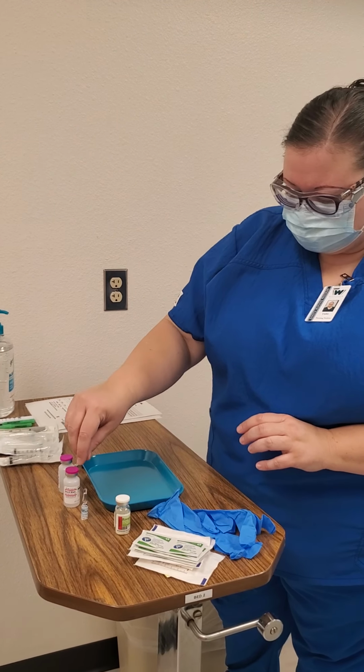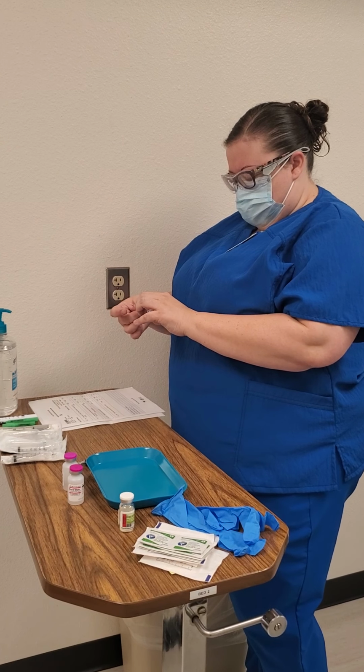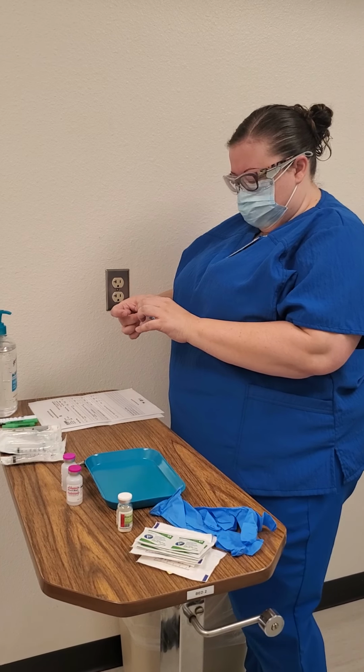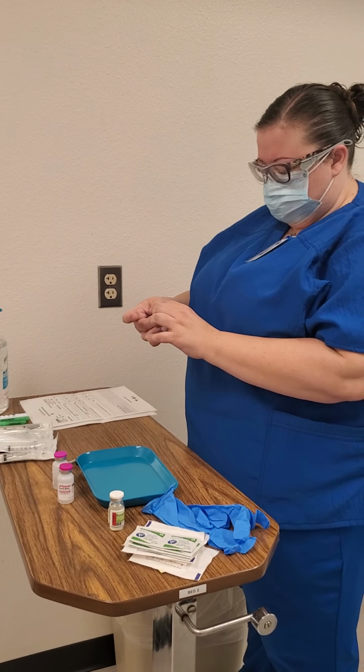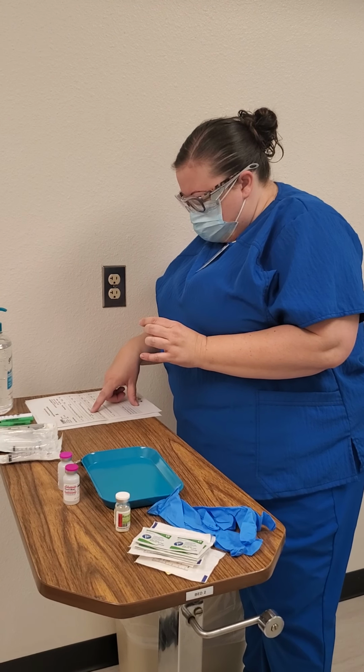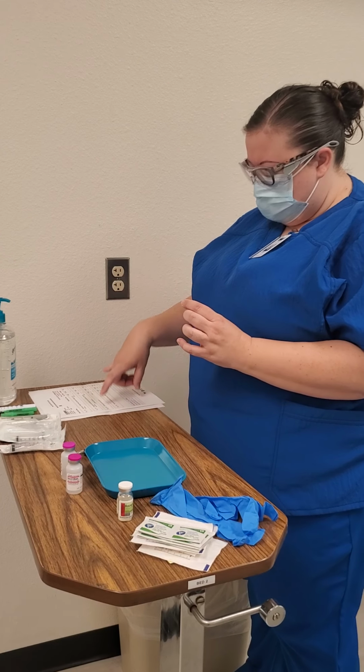And then I have the Phenergan, and that's 25 milligrams per milliliter on the bottle. Expiration date 3/20/33, and it compares with the MAR. It says Phenergan 25 milligrams intramuscular twice a day.